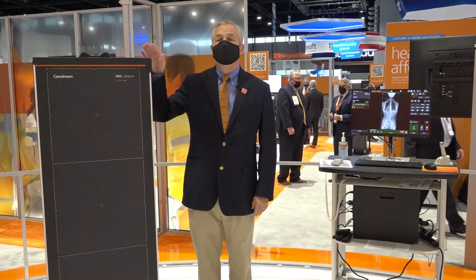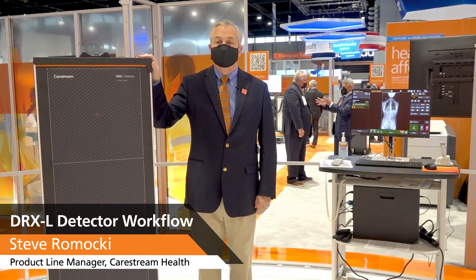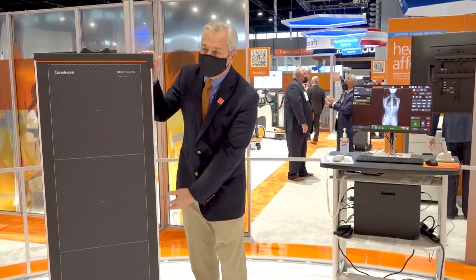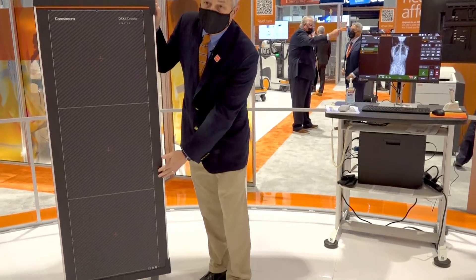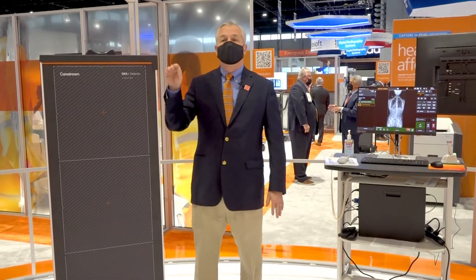Hi, I'm going to talk to you today about the DRX-L detector. This is a single-shot, long-length image detector. There are three detectors here. You can collimate any size you want for the image, and we offer this on two stands.